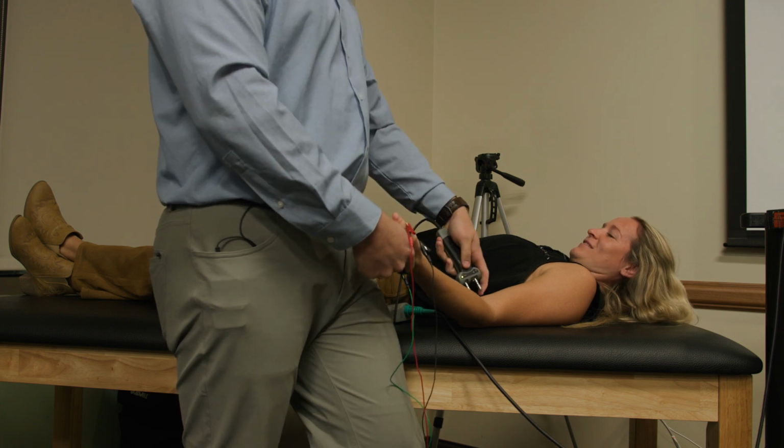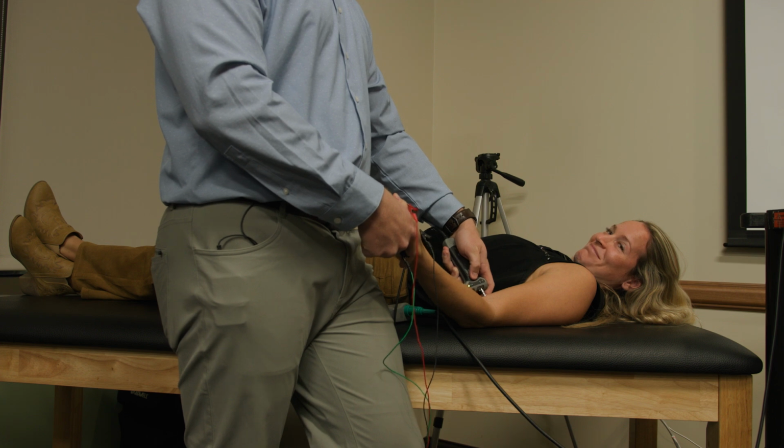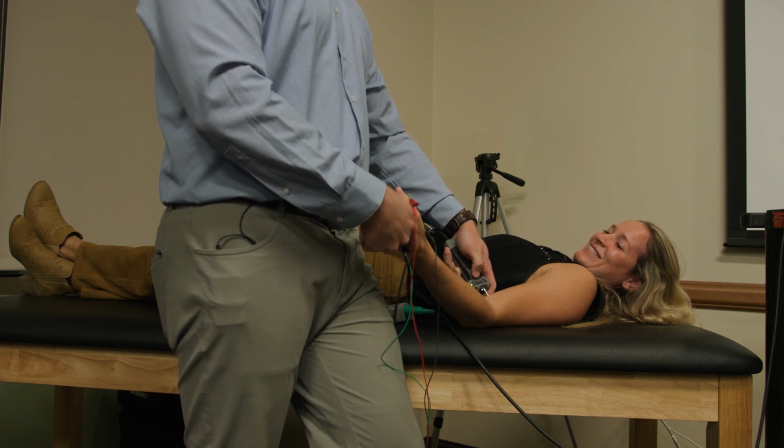Good. And then I'm going to come up to the elbow. This one's kind of a big jump. It hits more muscles downstream. A little pop here. One more. I lied, two more.